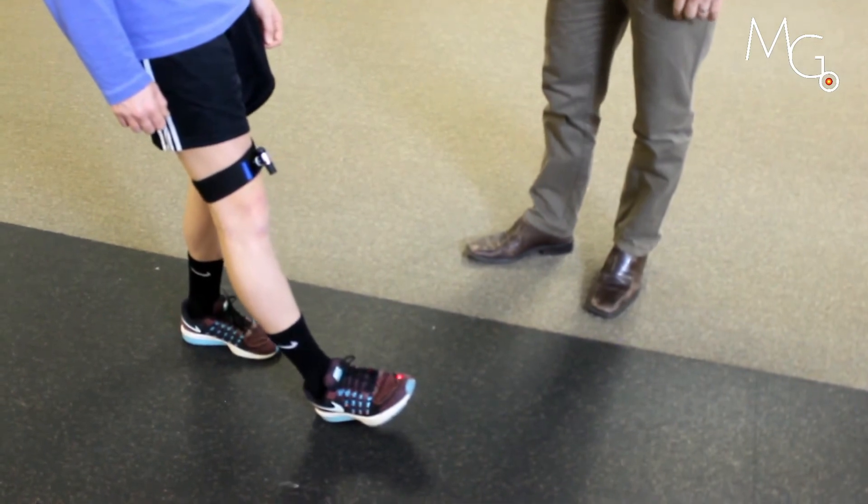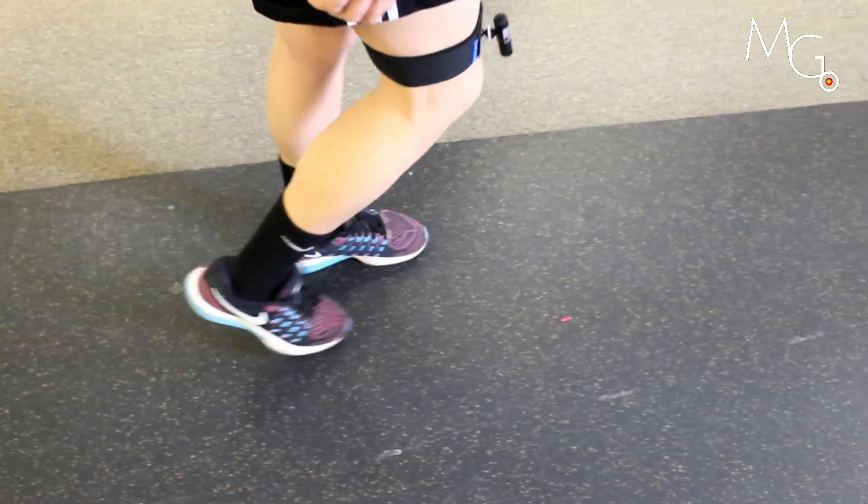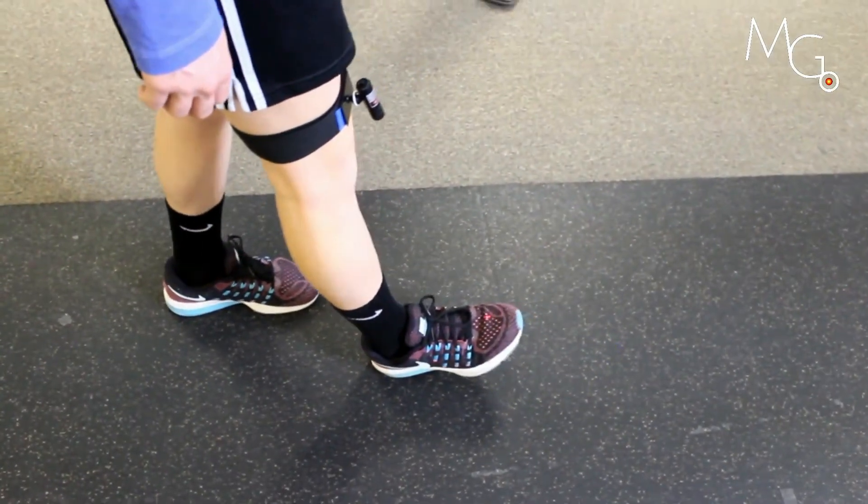Tighten up that knee and push that laser back onto that toe. Then transition over by walking through. Good. Hit your heel.